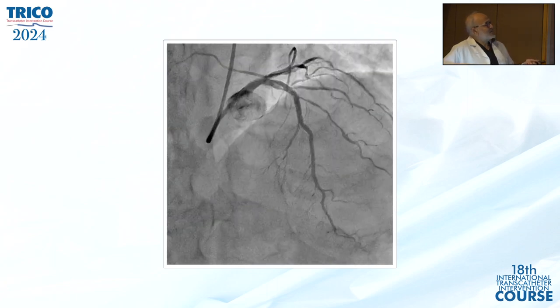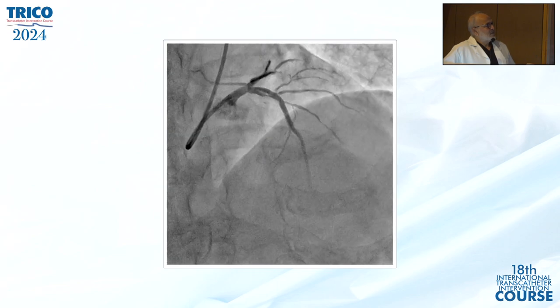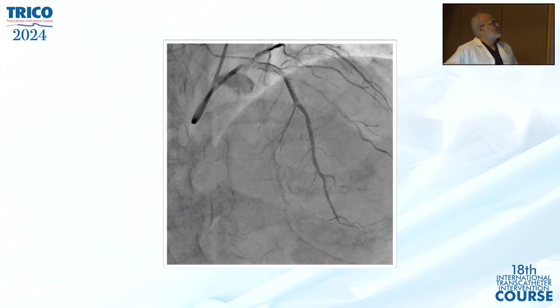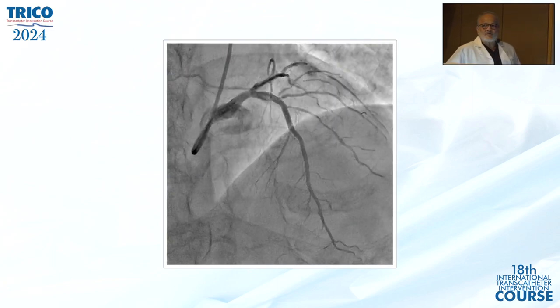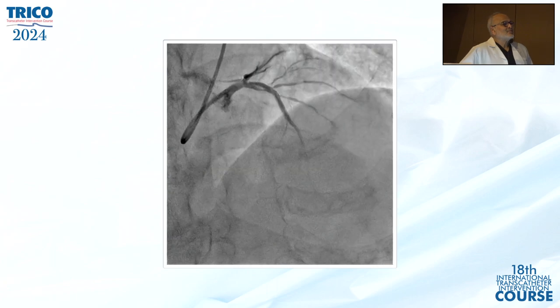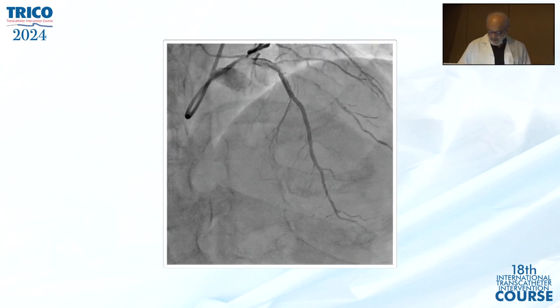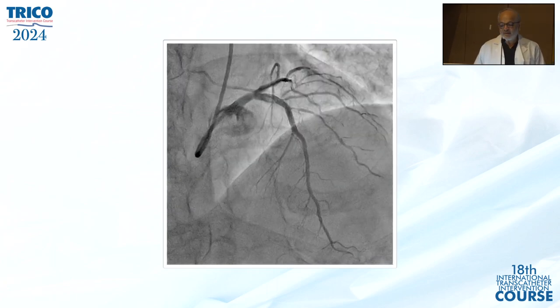What is this? Is this some sort of hematoma that happened there, or what is this? Is it some perforation or what? I think it's unexpanded, calcified, black, looks like. Yeah. Why did it happen, despite rotablation and everything?